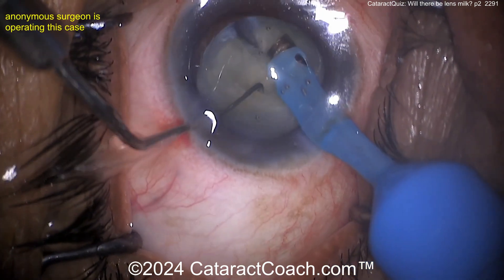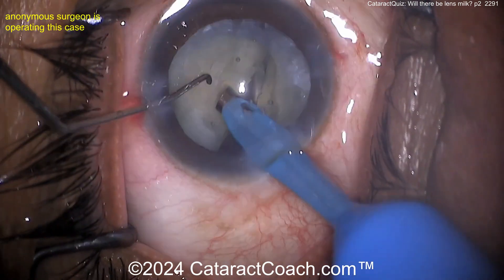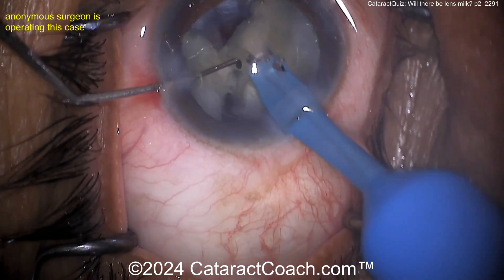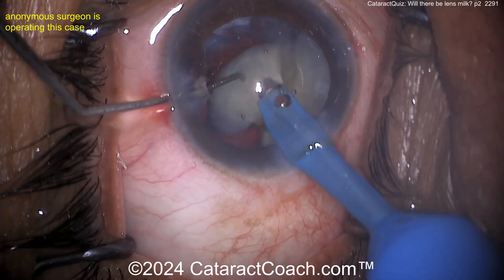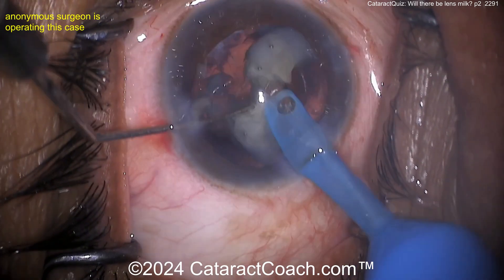That's a chunky-looking faco sleeve. Split that nucleus — there it is, down the middle. Look at all the stuff in the tear film. I'd clean all that up — hate to have all that oily stuff in the tear film as you're trying to operate, not just for your view, but think of all the flora that's on the lid margin.